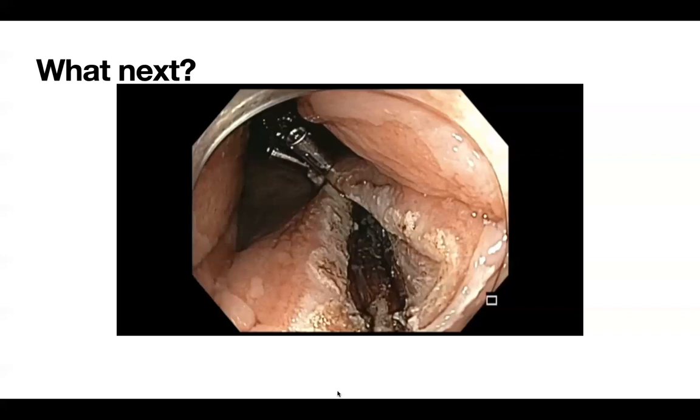If you had done the injection and then done what Raju had shown before, whereby he closed the snare and then lifted up slightly, opened the snare out, you would cut above the hemorrhoidal plexus, because the plexus is very much running over the muscularis propria, and you're resecting at a plane slightly above that. And the risk of bleeding is actually quite small.